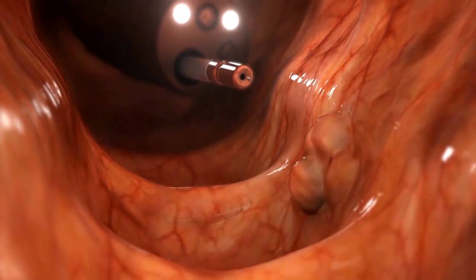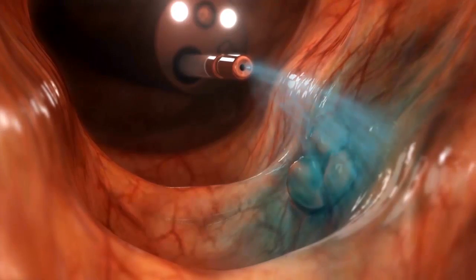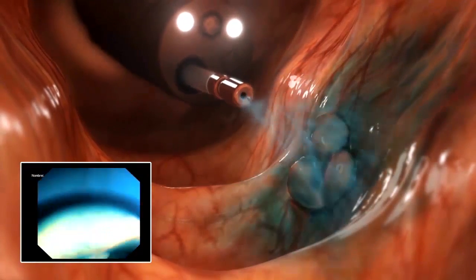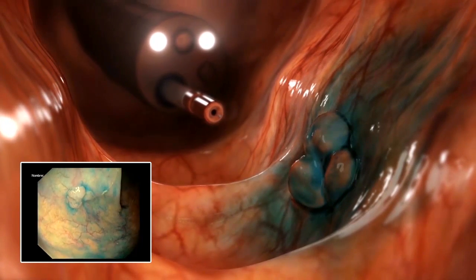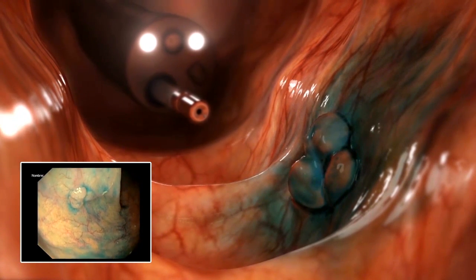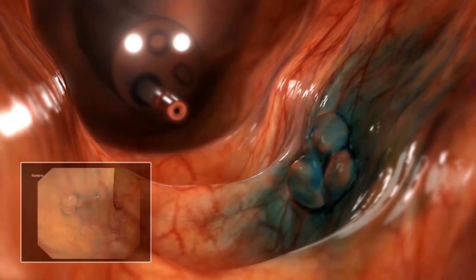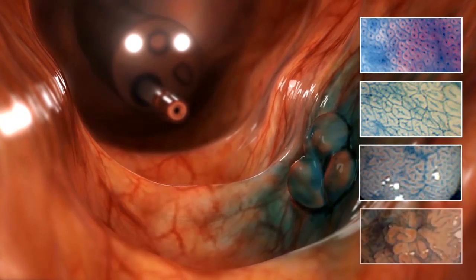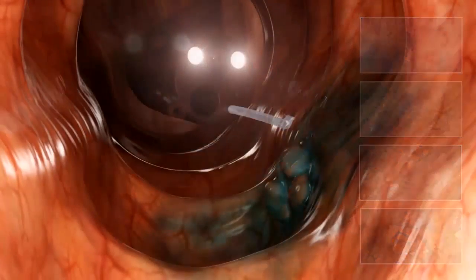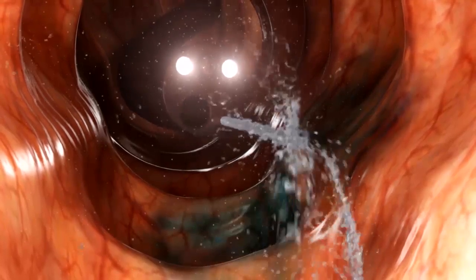Basically, two types of dyes are used. Methylene blue initially acts as a contrast dye and is then absorbed rapidly through the normal bowel mucosa. This process requires approximately 60 seconds. In the colon, no staining suggests dysplastic, neoplastic or inflammatory changes. Stable patterns are stable for more than 20 minutes. Washing after staining and suctioning the remaining dye is important for proper interpretation of the pattern.